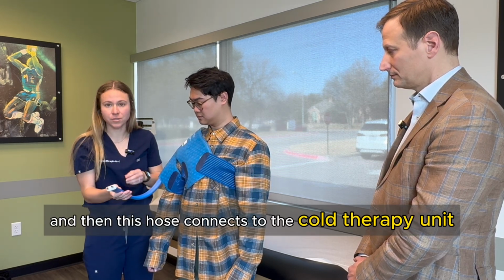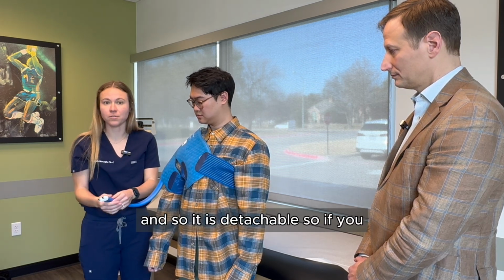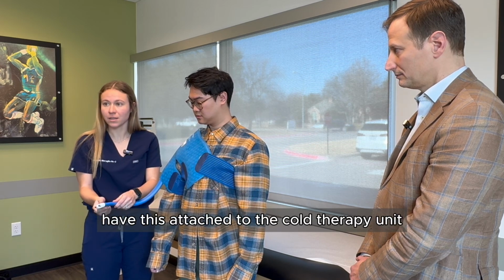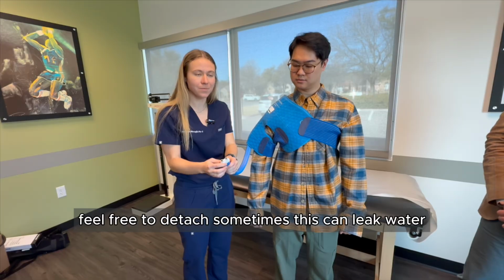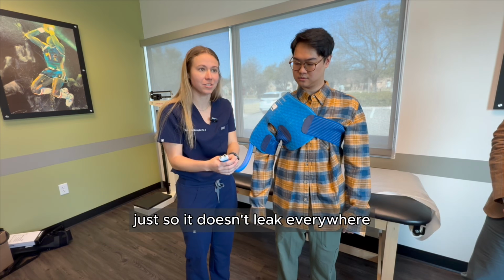And then this hose connects to the cold therapy unit. And so it is detachable. So when you're sitting down and icing, have this attached to the cold therapy unit. If you're done icing and need to move around, feel free to detach. Sometimes this can leak water, so sometimes patients will wrap a paper towel around it just so it doesn't leak everywhere.